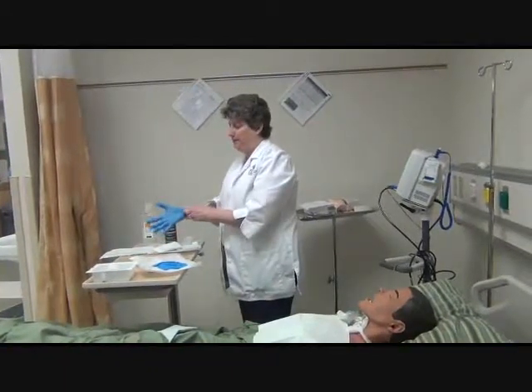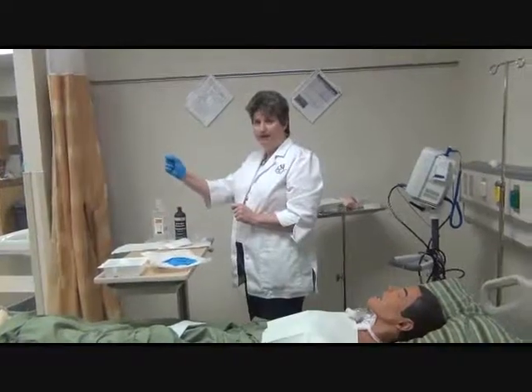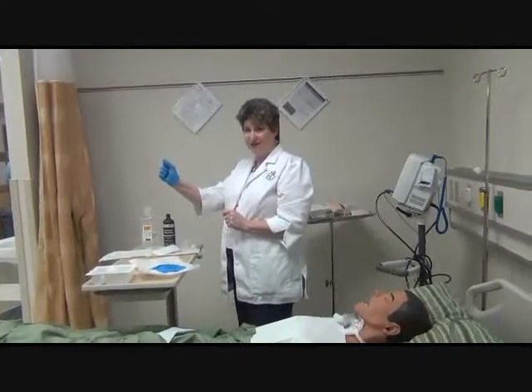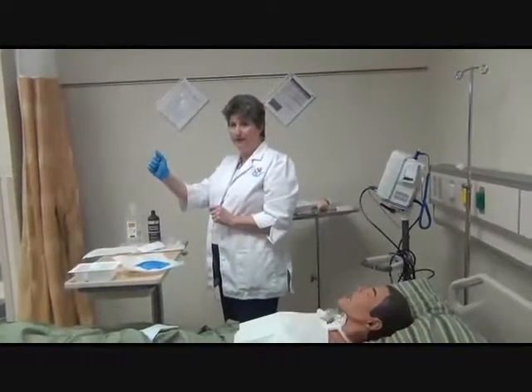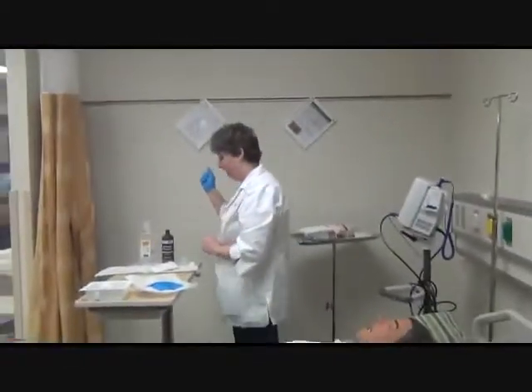And I'm going to keep my non-dominant hand clean. Once I've decided which hand is sterile, which for me I prefer to be my right hand since it's my dominant, I'll make a fist so I don't accidentally grab stuff.